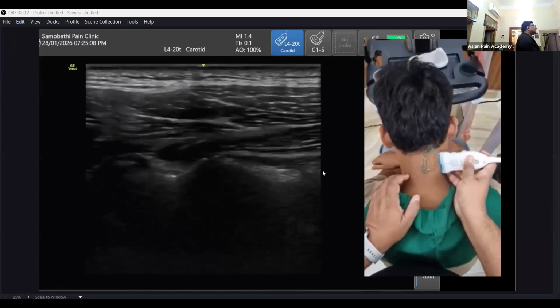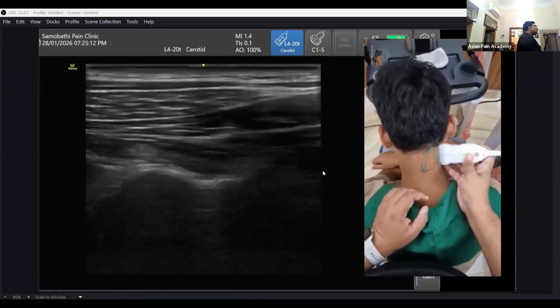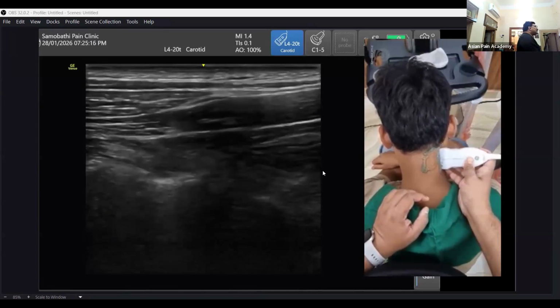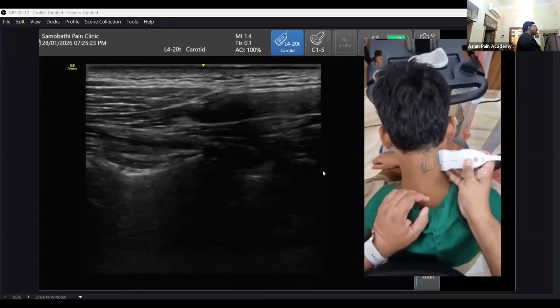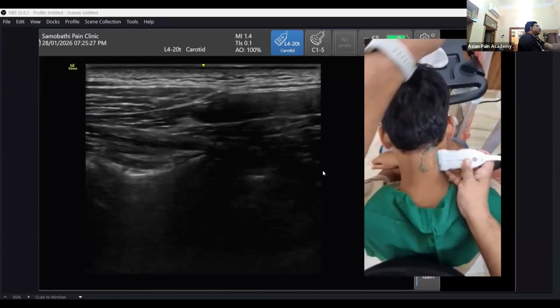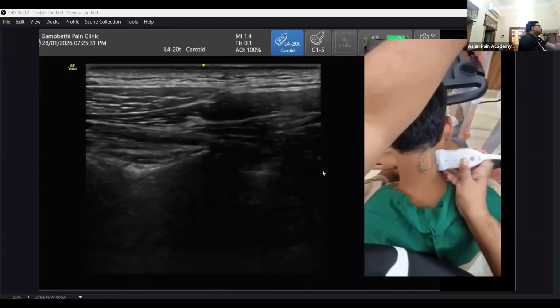Okay, then, I am holding it opposite. Just 1 second. So here is the first one. Then I am coming, I can see the second one. And see these undulations typically in the lower part. That means here you can see at this point. Just 1 second. So nice.